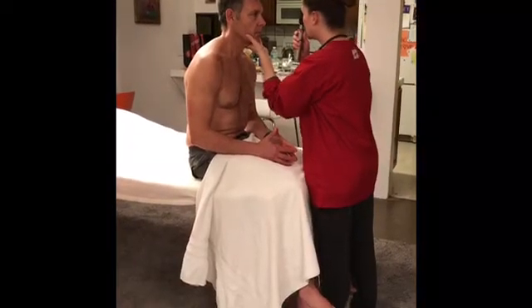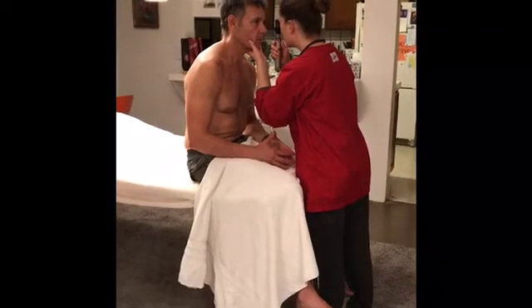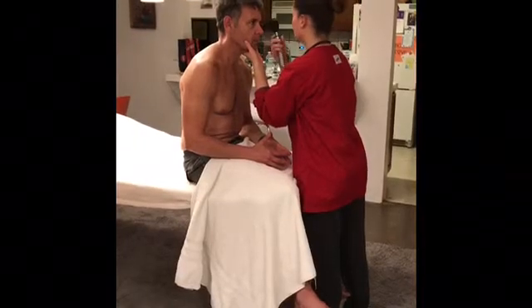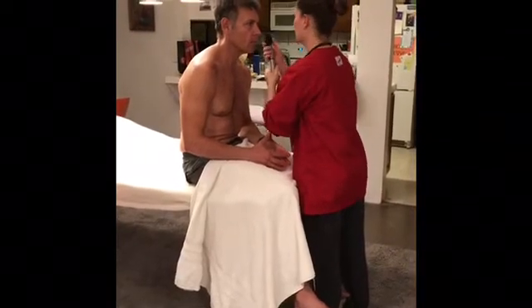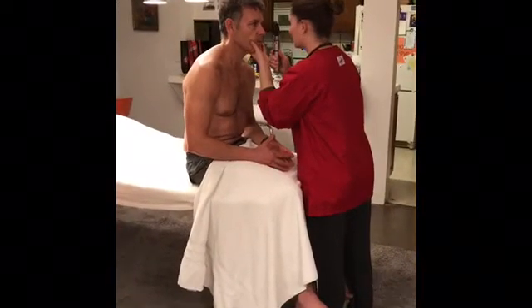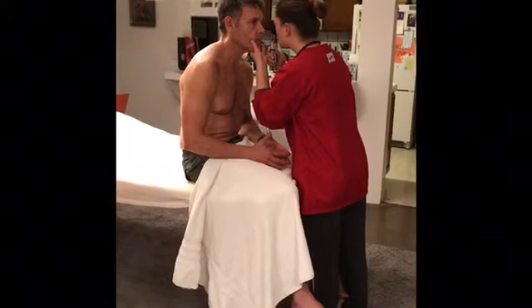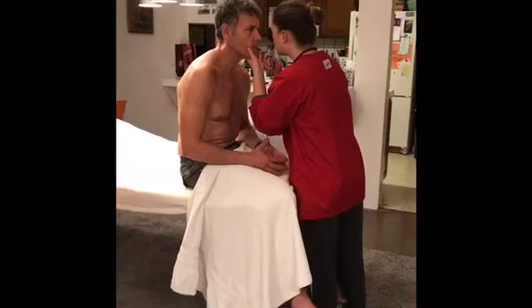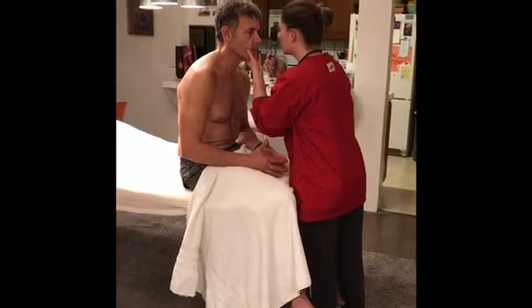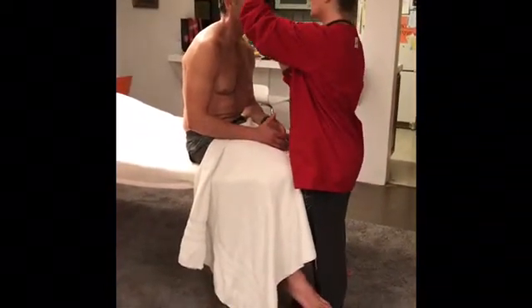And then you're going to come in and look closely into the patient's eye. Hold on one second, sorry. I don't have that open right now. When you're looking in the patient's eye, try not to blink, visualizing the optic disc and seeing any nerves that you possibly can. Go ahead and do the same thing on the other eye. Go ahead, look straight ahead, straight at me.